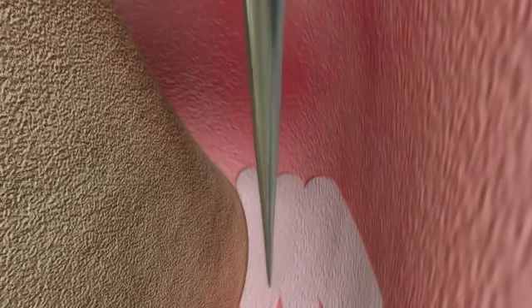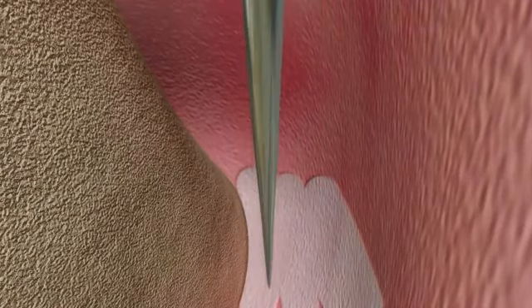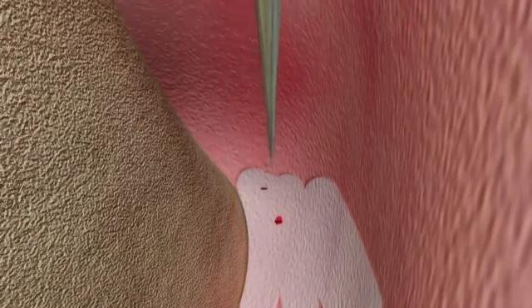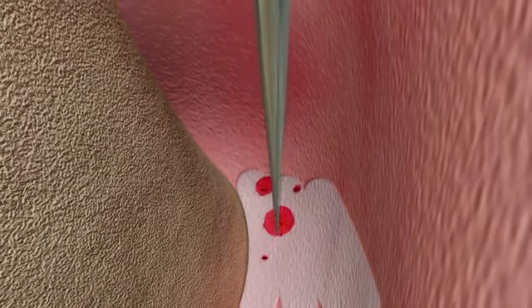An endodontic explorer is used to confirm that all soft tissue has been removed from the bone, so we get great regenerative factors coming from the bone. Next, the endodontic explorer is used to slightly perforate the cortical bone to get good angiogenesis and release the regenerative factors from the bone.